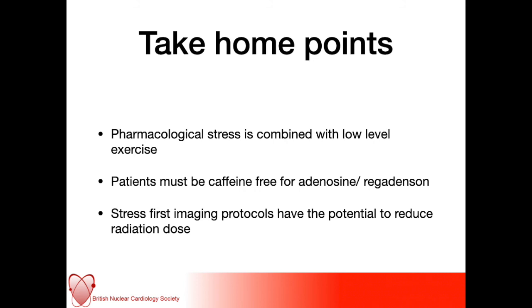So for reference to your patients, they very often will have pharmacological stress, and this is combined with low-level exercise. Patients must be caffeine-free if they're coming for adenosine and regadenoson, and there's a potential to reduce the radiation dose if you perform stress-only imaging, stress-first image protocols.